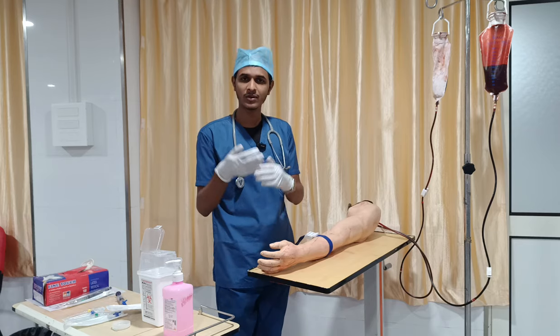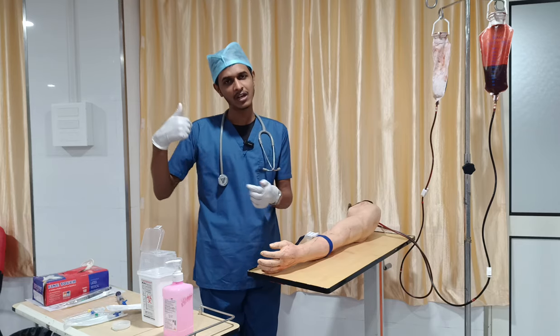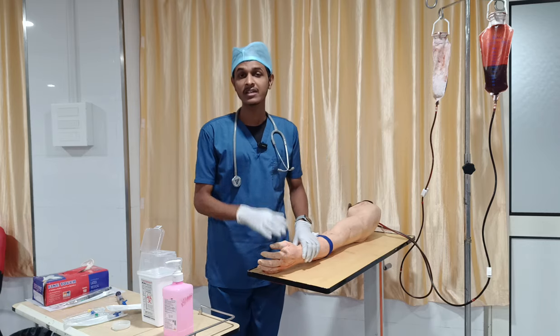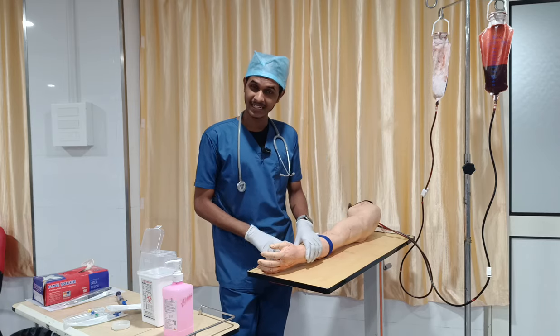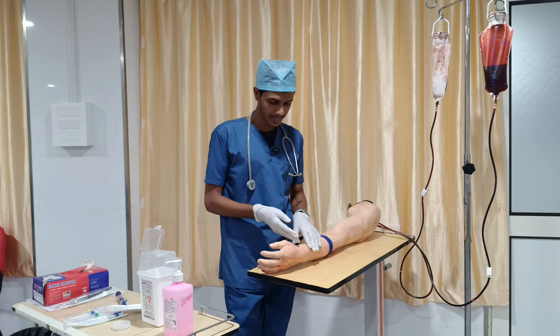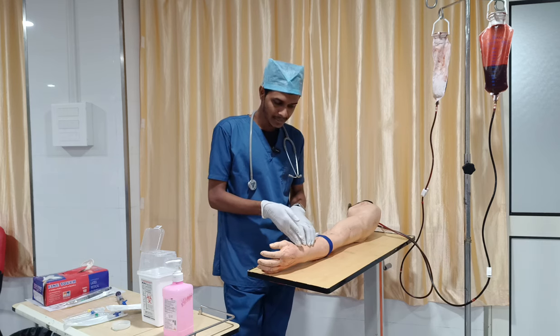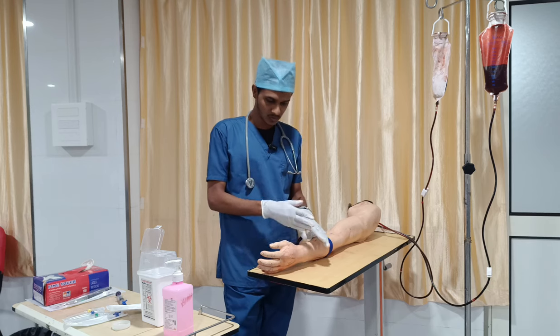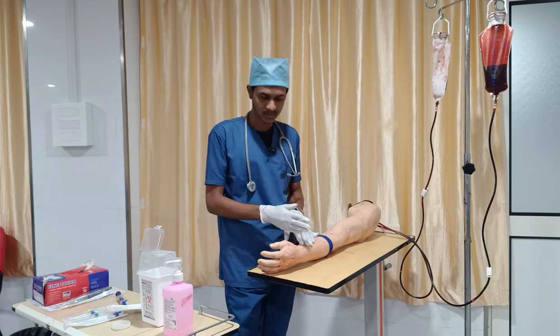That is why you should try from the distal region to the proximal region. Again, one more important thing: you should not choose the creases or the joint region. Mainly in cephalic you can go, but in cephalic also you can choose more distally or proximally, while inserting the cannula.